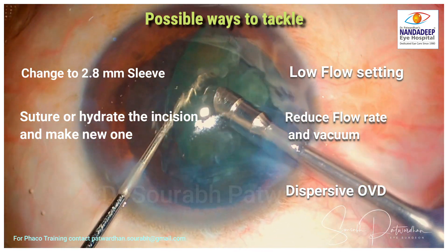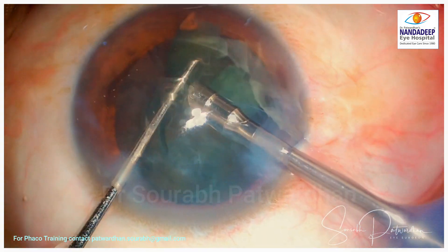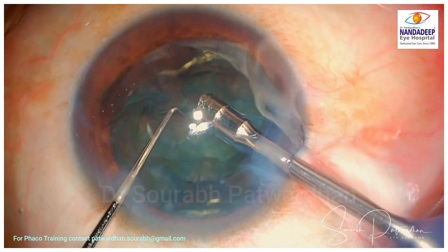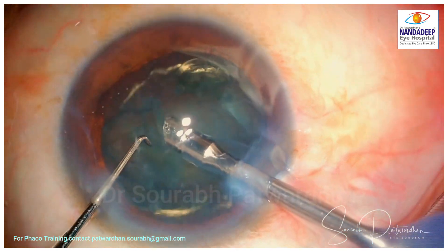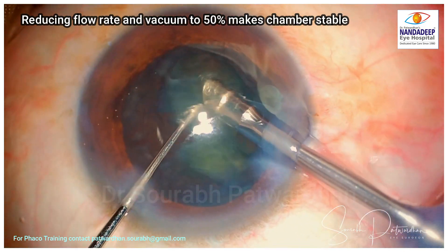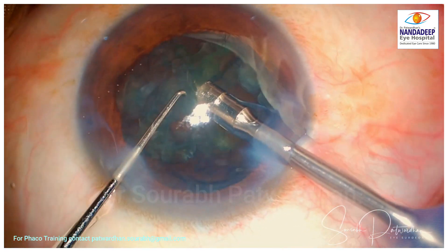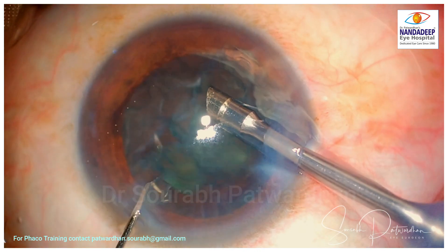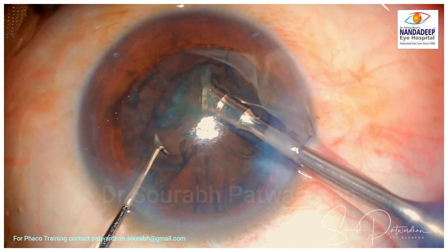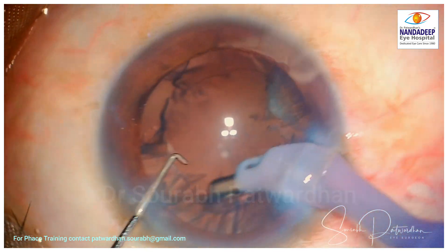I am going to ask my assistant to start reducing the flow rate and the vacuum proportionately until the anterior chamber is stable. Still you can see there are fluctuations, so I ask my assistant to reduce the vacuum and flow rate further. I noticed that when reduced to 50% of the original parameters, the anterior chamber is quite stable, and I could emulsify the rest of the nucleus without a high risk of posterior capsular rupture.